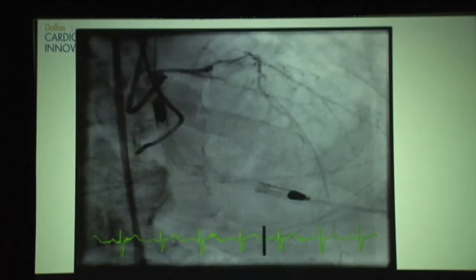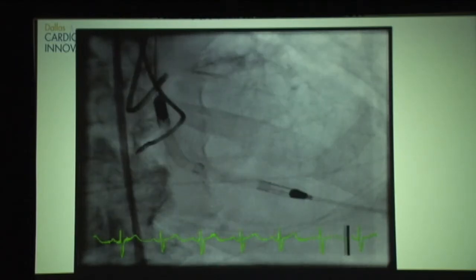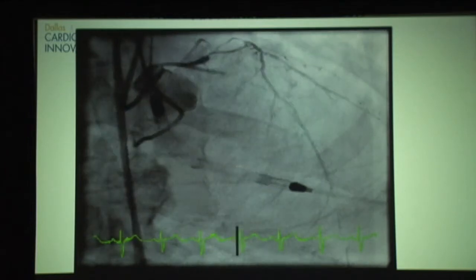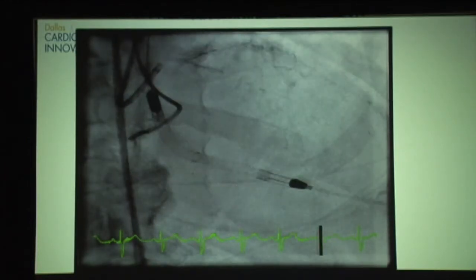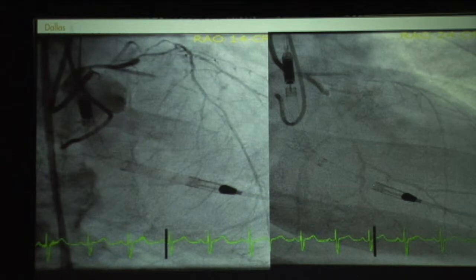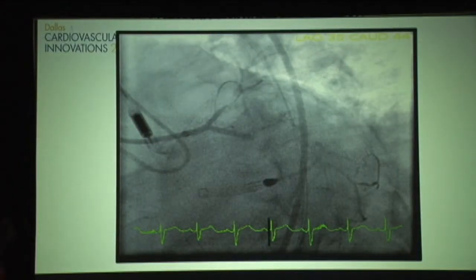So here we have 2 injections simultaneously, and I think you can begin to see that we learned a lot of things. Number one, we learned that the LAD might not even be completely occluded. That was a surprise. And number two, as we'll see in some other pictures, the occlusion in the circumflex, while complete, was, as we kind of suspected, quite short. Here are a couple of pictures, caudal on the right, and again you can see that the circumflex occlusion does appear fairly short, and the LAD might even be a subtotal occlusion. So that was a gift.